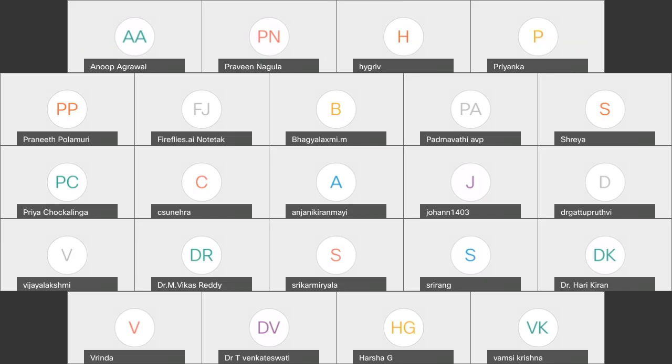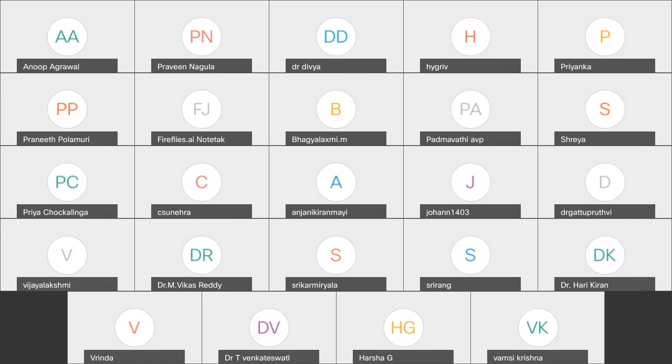So much so with the data that is available, especially with Dr. Marin's group and Dr. Chan's group, they have a lot of evidence to say that irrespective of the absence or presence of some of the other factors, a significant gadolinium enhancement, which in layman terms means more the fibrosis, more the volume of distribution, and more gadolinium gets stuck and comes out later. So we have a way of picking that gadolinium in transit, and we are able to now, with good software, quantify. And the number that has come out of two studies, which was done about 4 years ago by Dr. Marin's group, is 15%.